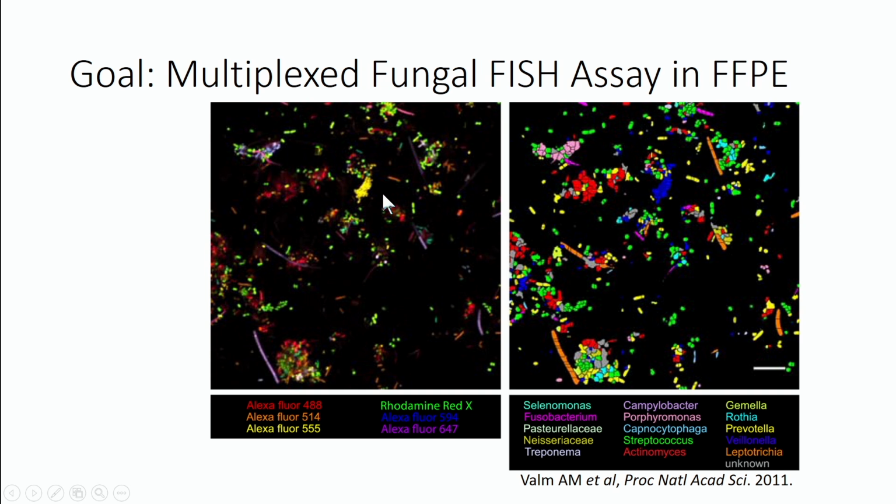And then after linear unmixing and decoding these combinatorial labels, you can assign taxa and get a false color image, and you can actually see where the different organisms are interacting. This is useful on the basic science side, trying to understand how complex communities interact. But I think for us, it really becomes a potentially powerful diagnostic tool when PCR doesn't work.